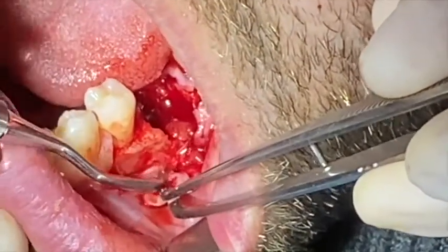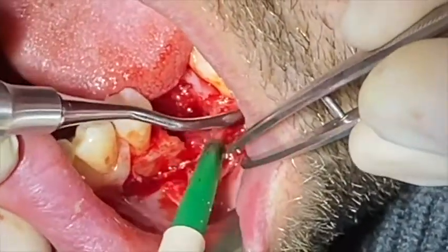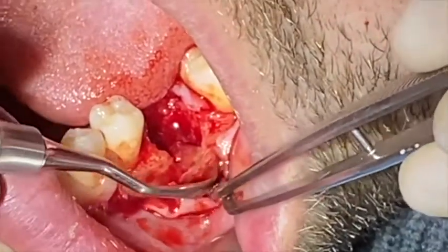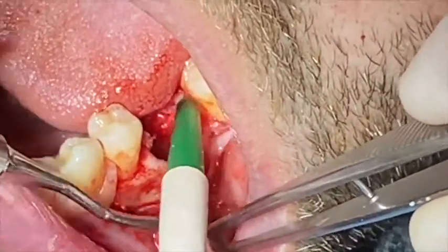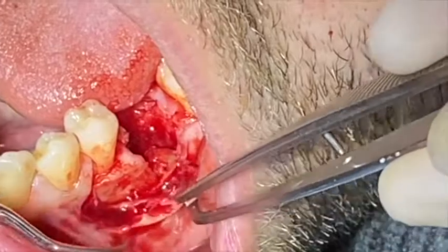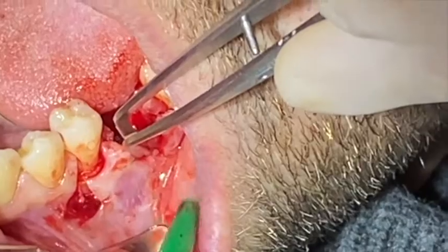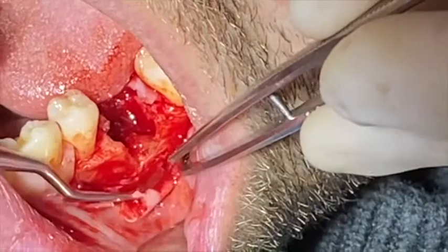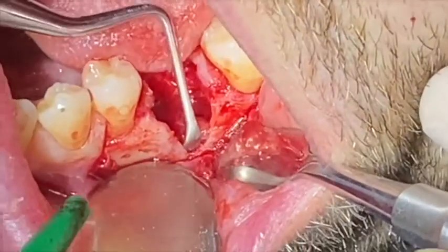Now I'm using a specific kind of instrument — it's not a chisel, it's not a back action — it's a periotome or periotome that is curved. And I am scratching the bone. That outer part of the bone, there is no bone there. It's protected because I'm using a curved instrument, so I'm not touching the flap and not pushing the flap. There's no way to tear the flap.